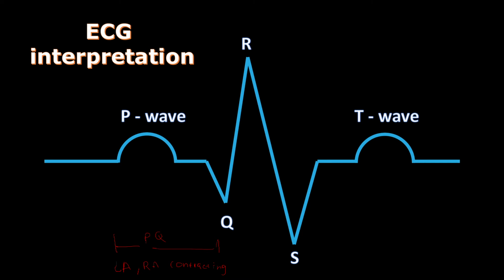Okay? During this phase, the QRS complex marks the firing of the AV node. So the AV node is very important here and represents ventricular depolarization. I'm going to refer to depolarization with letter D, known as contraction of the muscles, and repolarization with letter R is going to be referred as relaxation of these muscles.